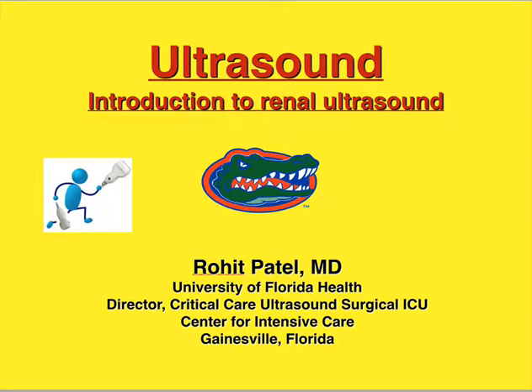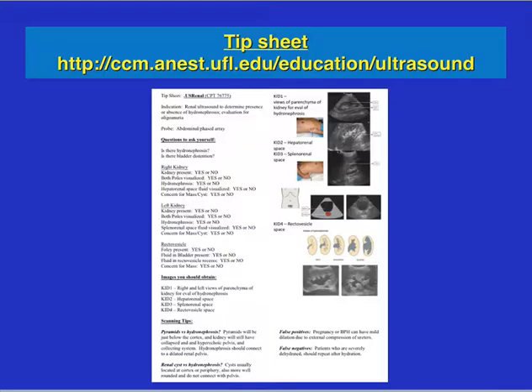Alright, so in this lecture we're going to talk about an introduction to renal ultrasound and how it pertains to the critical care setting and emergency medicine setting. There's also a tip sheet located in this module that goes through the renal ultrasound that we do here at University of Florida and what kind of things you should be looking for.